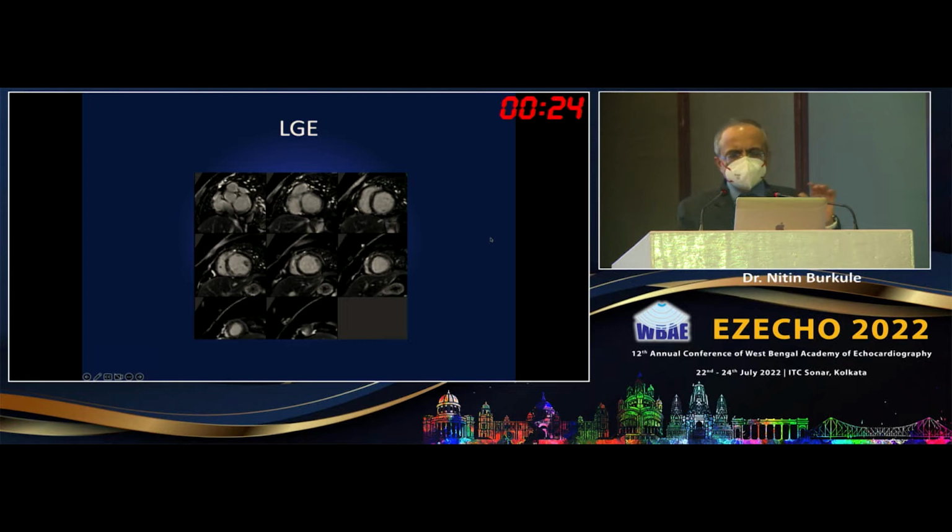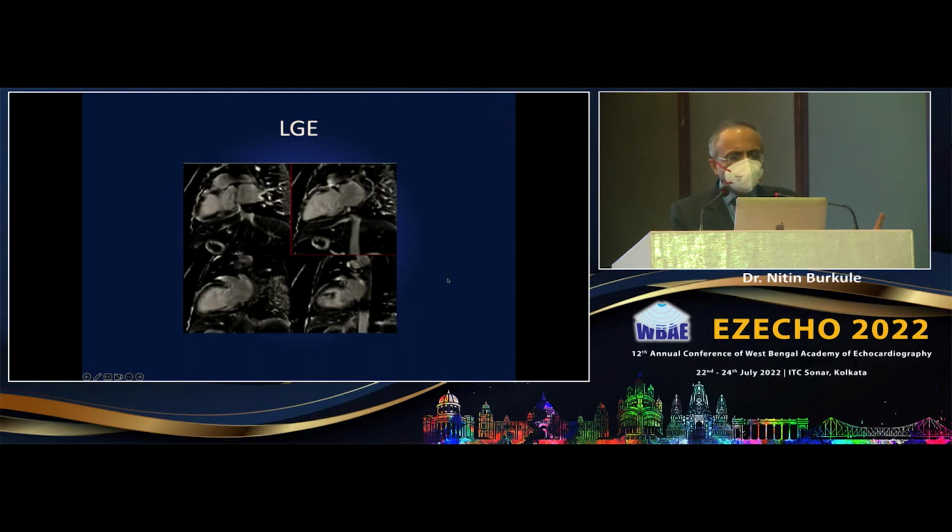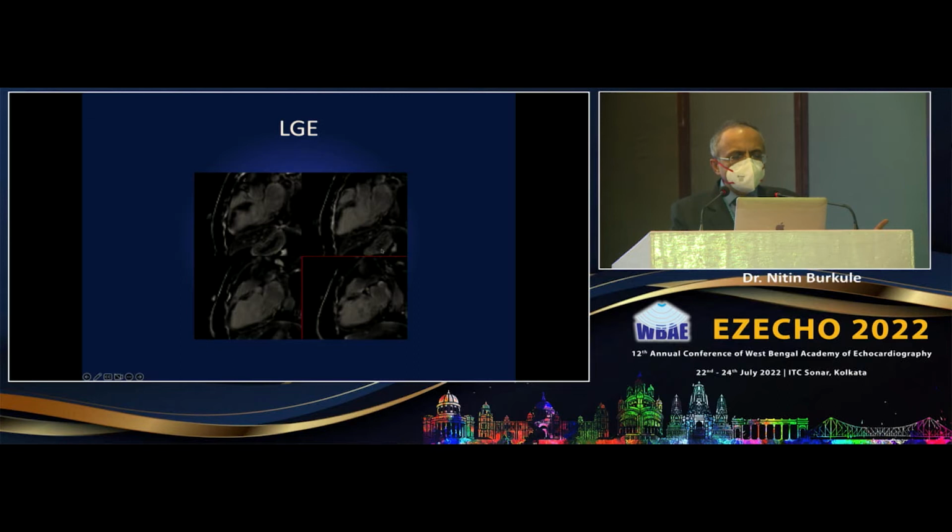Now we will look at the LGE, and it is interesting to see that the basal septum has a lot of focal LGE, a lot of areas of focal LGE at the basal slices. If we look at the long axis, you can see that there are certain ones which are going transmurally, but definitely they are not like a coronary territory involvement. Then there are some where there is subendocardial preservation, with mid-myocardial enhancement. Here you can see that there are small blobs of LGE there, more predilection at the base. And so also in the long axis views, you can see some of those areas. You can see one here also, one here also.